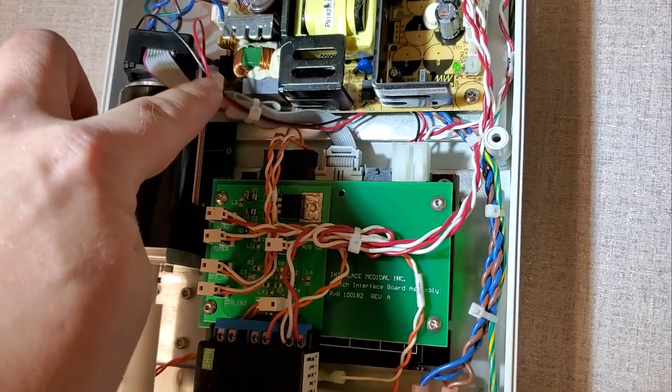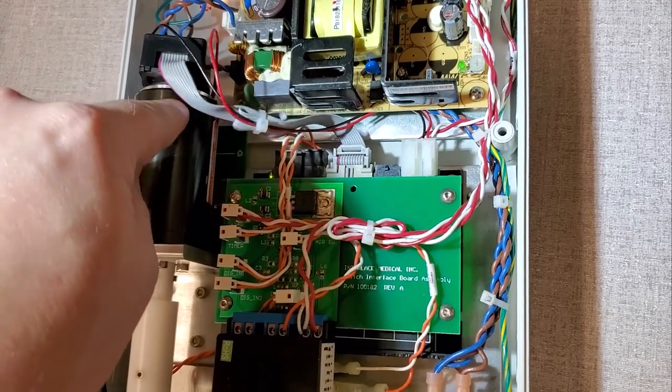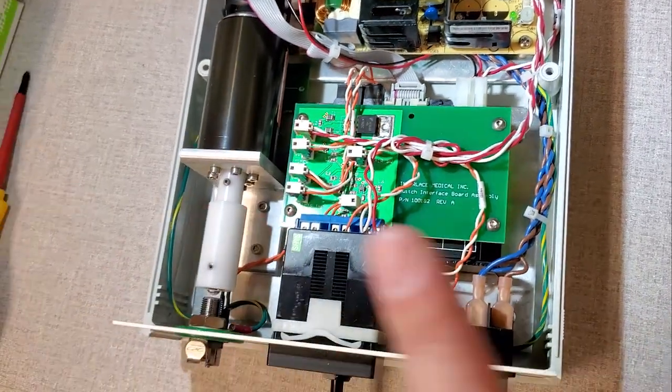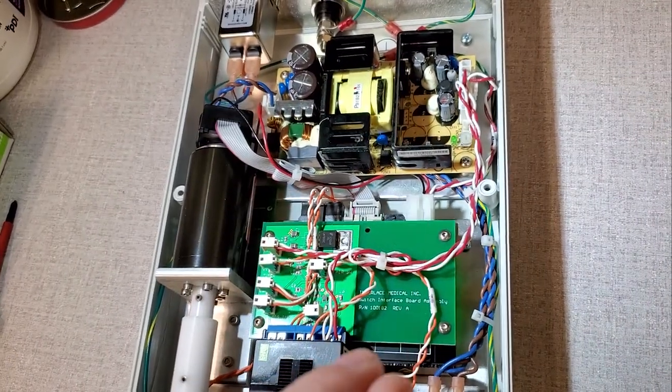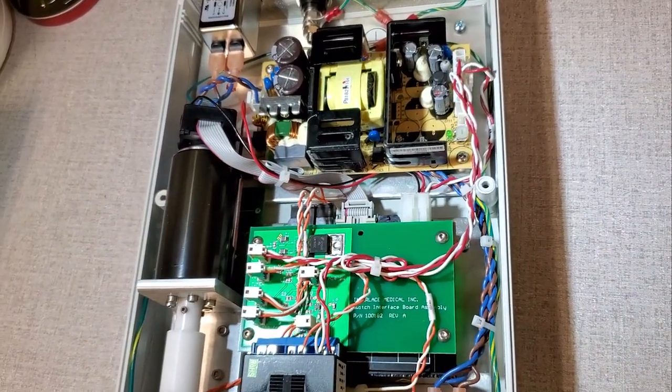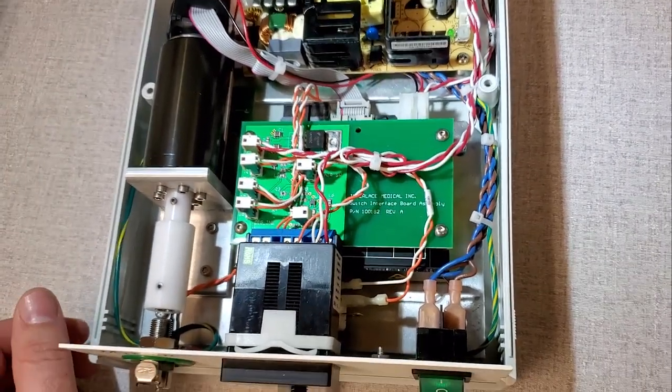And this is going to be regular DC. You can see that there's two wires right here instead of the four wires that were on the stepper motor. And that tells me that it's pulsing DC on those two wires until the motor reaches its designated amount of time and then it stops.